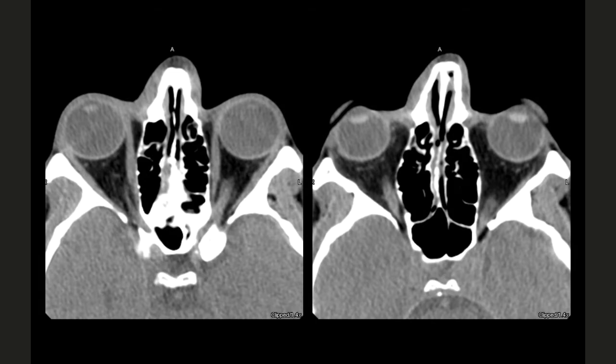Can I always see the third nerve or anything? Not really, but if I see a mass in that region, then I will know what is located in this region. So maybe there is a third nerve schwannoma or some other tumor, whatever is going on. So know your anatomy, right? Optic canal, superior orbital fissure, optic nerve, the recti muscles, globe.